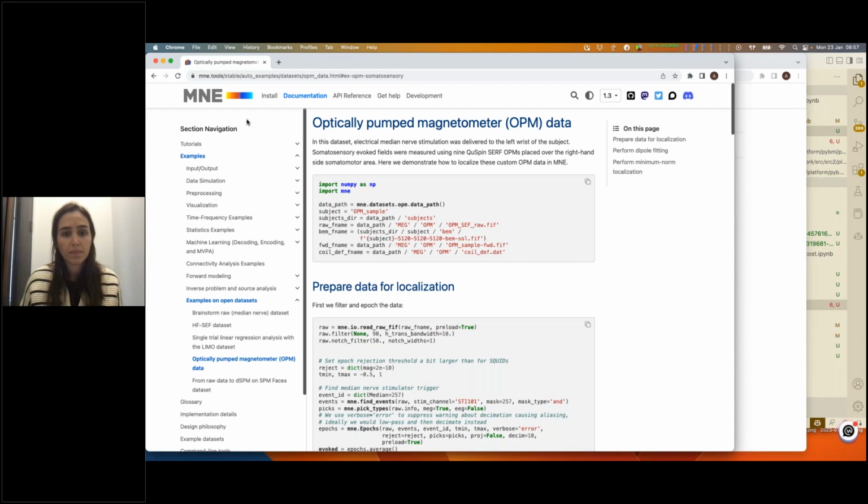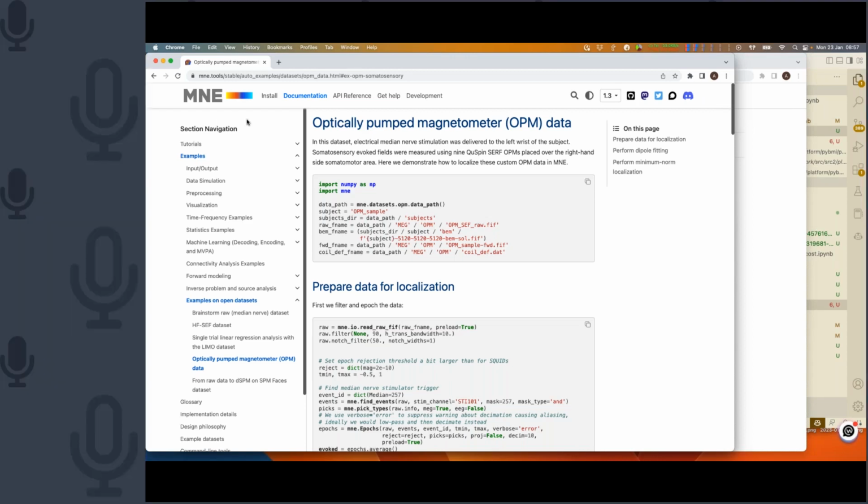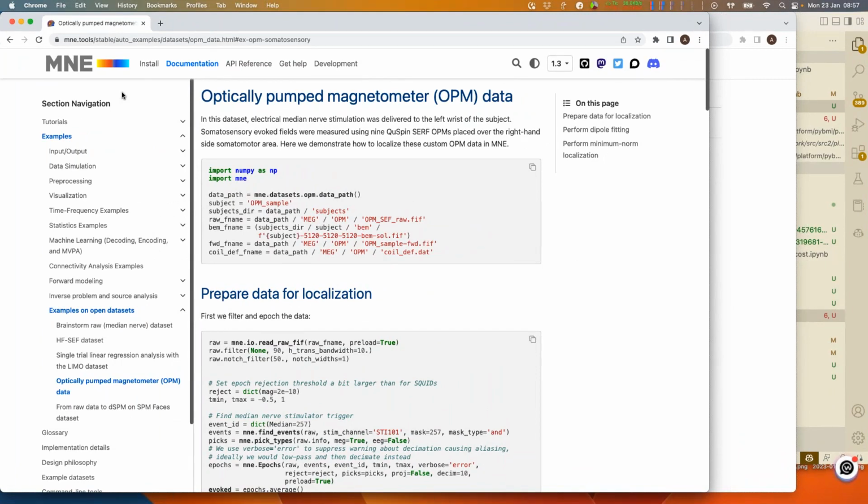To be able to use MNE-Python, you need a bit of background knowledge of NumPy and of the scientific Python ecosystem. I think that's a bullet you need to bite a tiny bit. It's like in MATLAB: if you want to work with MATLAB, you need to be able to work with matrices and these types of things. So I guess there's no free lunch. You'll need to learn a bit more of the basics of the Python programming language, and there are plenty of videos and tutorials to do this.